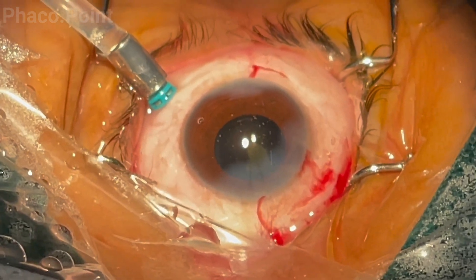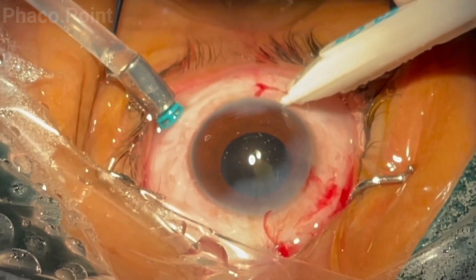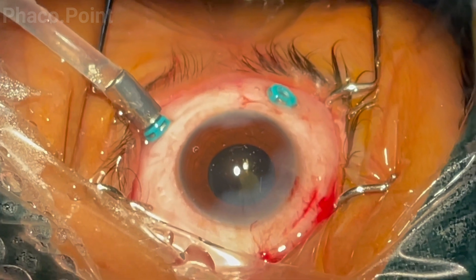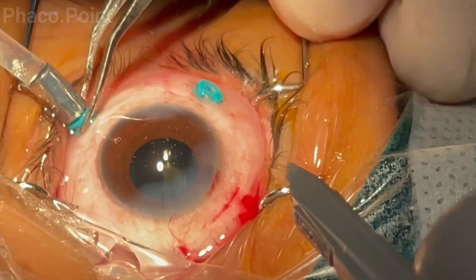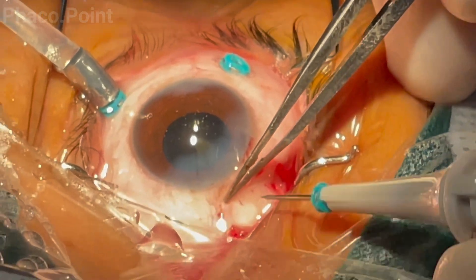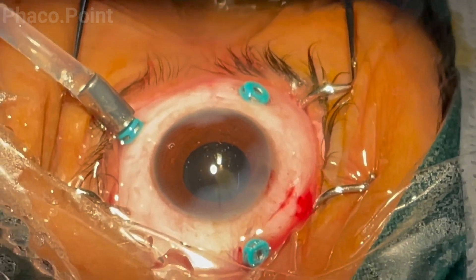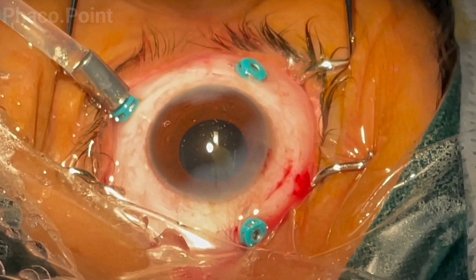The surgeon now proceeds to making the two superior ports. Note how the posterior end of the trocar serves as a guide to decide the point of entry. At the proposed point of entry, the conjunctiva is retracted before the trocar is introduced. For the third port, the eye is stabilized, the 4mm mark is made, the conjunctiva is moved away, and entry is initially tangential before the direction is turned toward the posterior pole. This completes the creation of the three ports using the trocar cannula system.